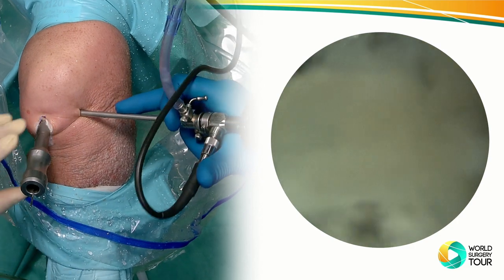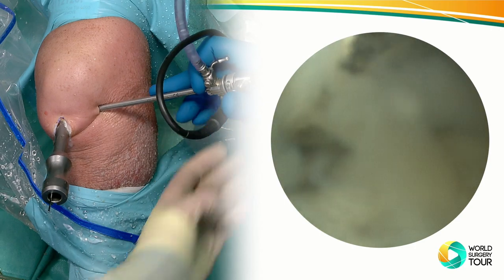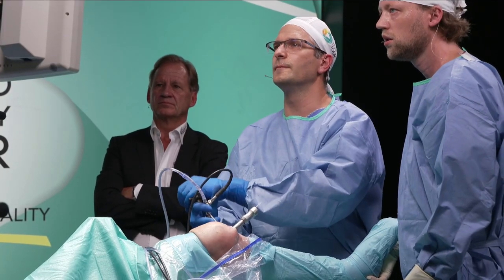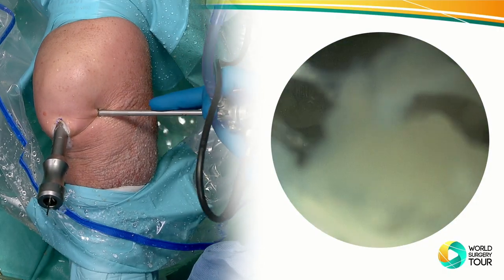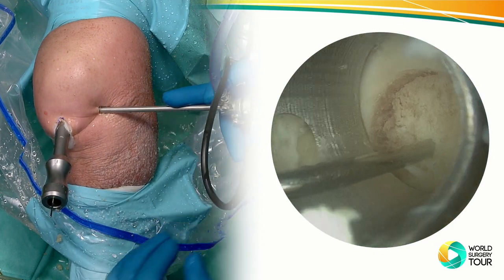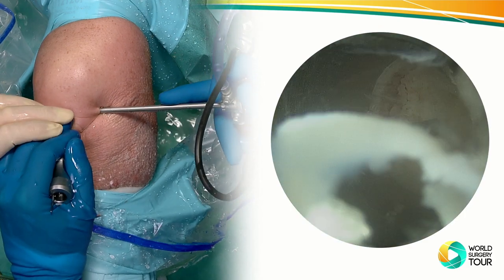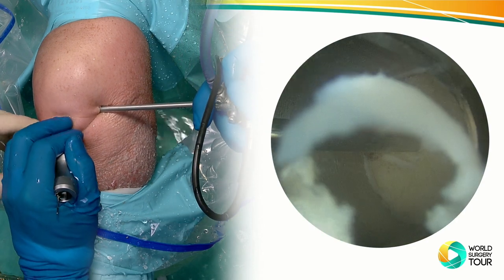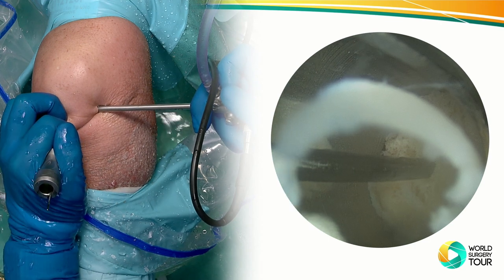Okay, let's get the water in going again. Okay. So we keep removing now the cartilage to a point that it really becomes clear. So I need the reamer again. What you see? The cannula has moved a little bit. So if that happens, you can check through the window what happened. You reposition it, and then you actually have to remove the central wire.